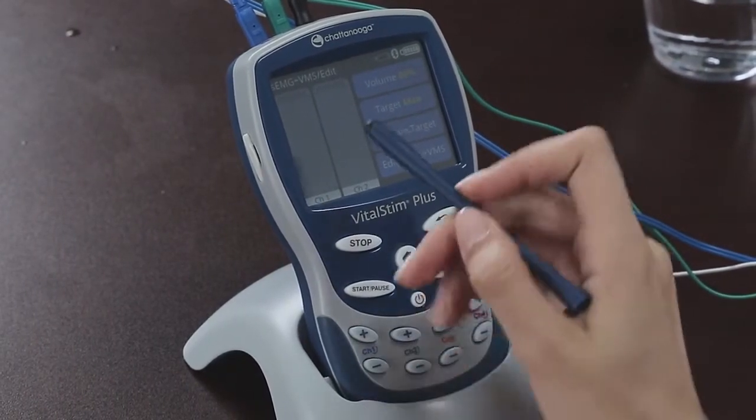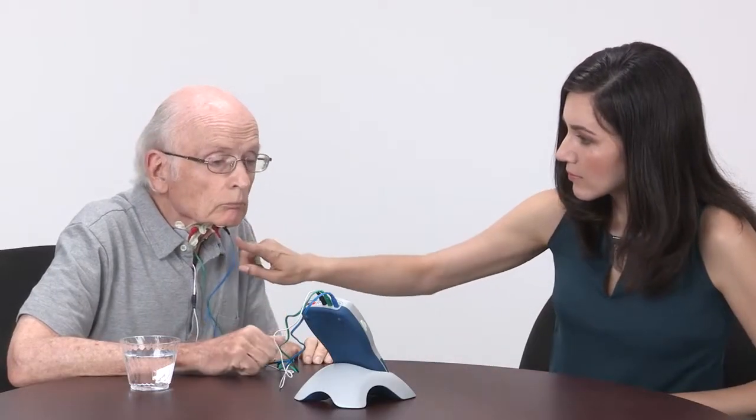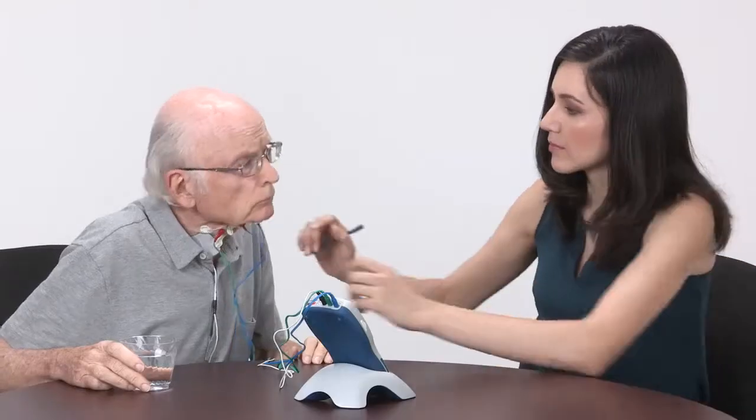First, let's make sure that channel 1 is connected to the triggering muscle group. In this instance, it will be the geniohyoid. This is where we want to focus the patient's attention. Channel 2 will be delivered to the thyrohyoid muscles. This is where the stimulation will be delivered.